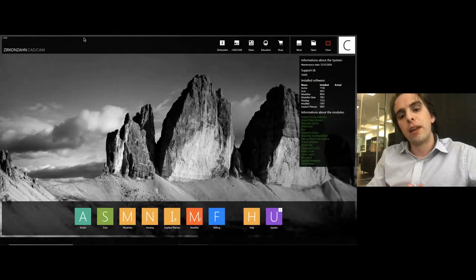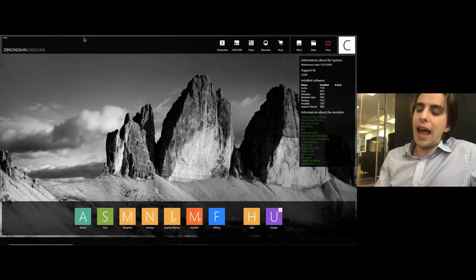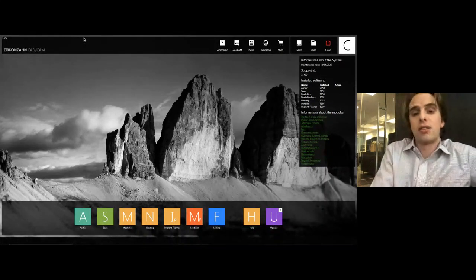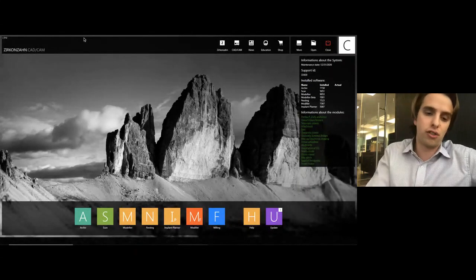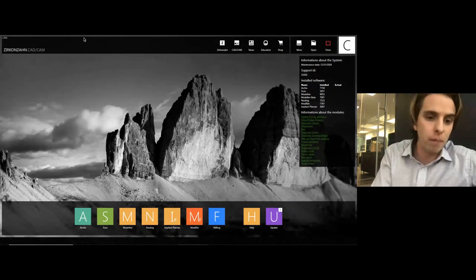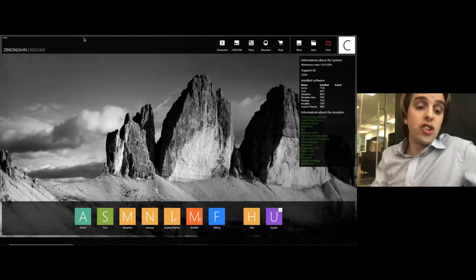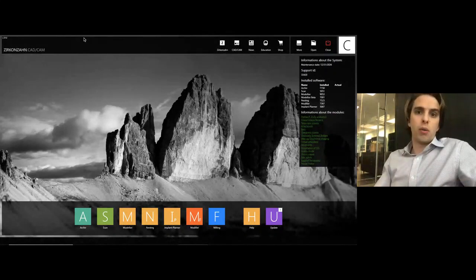So starting at the beginning, when we think about CAD/CAM, we should really draw an analogy to the conventional laboratory method. And what you see on your screen is basically the Zirkonzahn software desktop. And this is laying out our workflow through a series of software applications you see running across the bottom panel here. So we have, again, this analogy to the analog world where what happens when we receive a case?